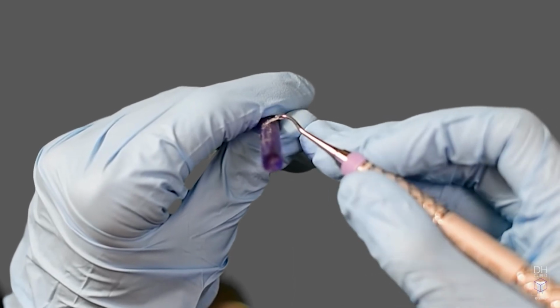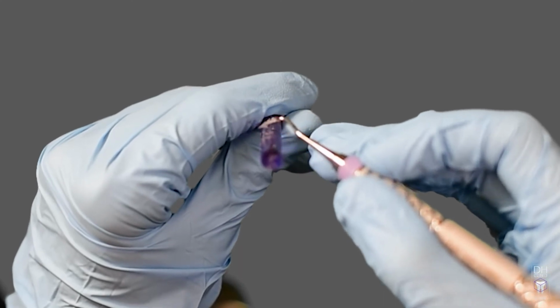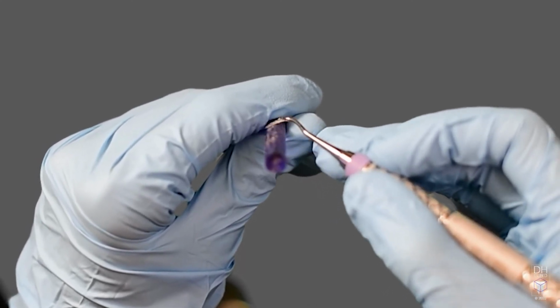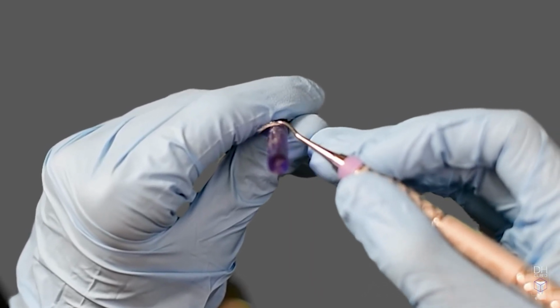When sharp, shavings will come off of the test stick. If dull, the instrument will slide around and slip. The same thing will apply to the patient's tooth. If slipping on the test stick, it will slip on the tooth as well, potentially harming the patient or you.